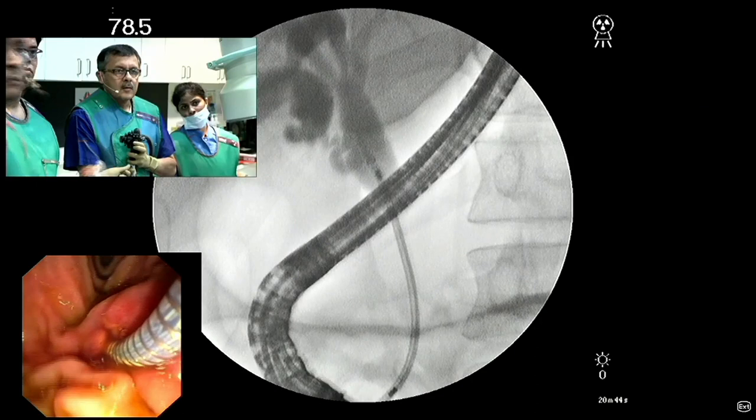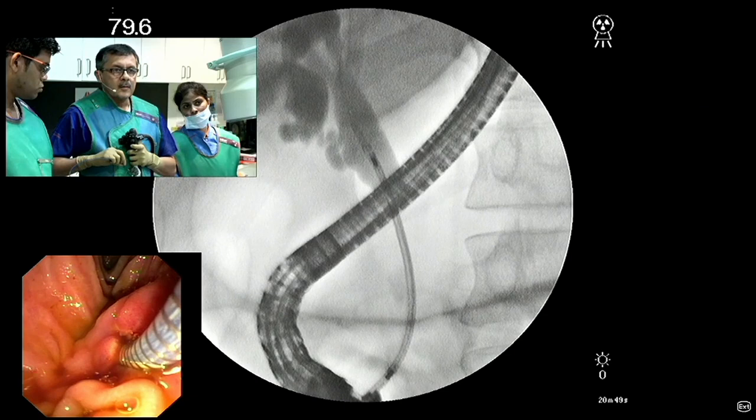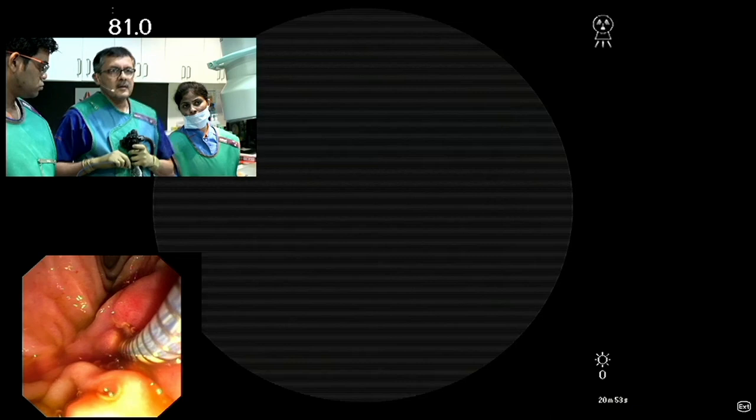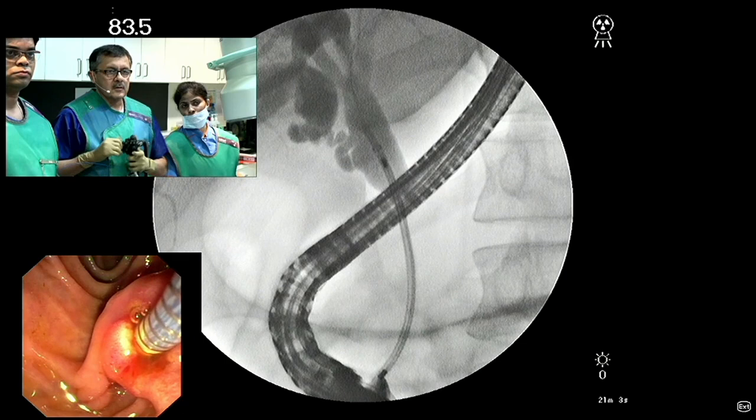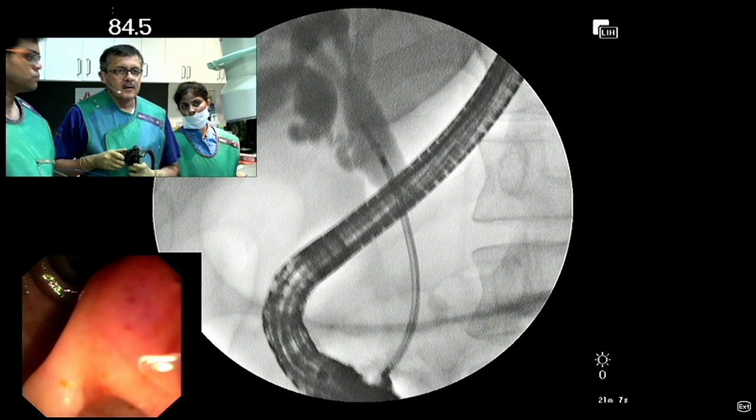So how close to the hilum can you get, Amit, if this patient potentially would go to surgery? Do you have to stay a certain distance from the hilum for the surgeon? Yes. At least about 2 centimeters below the hilum. That should be sufficient for the surgeon for doing an anastomosis. Rob, fortunately, I am myself a surgeon, so I have done these surgeries before I gave up surgery completely.